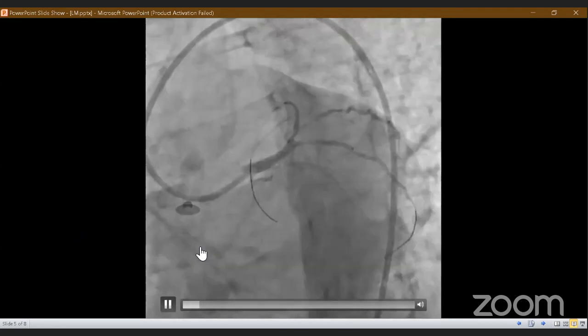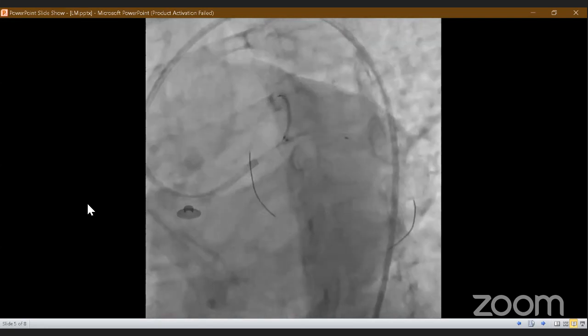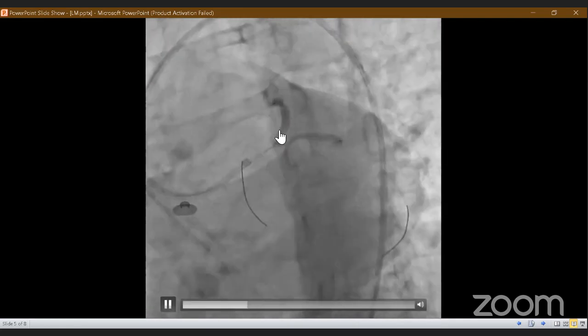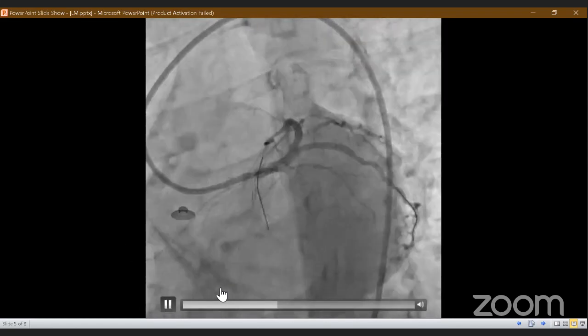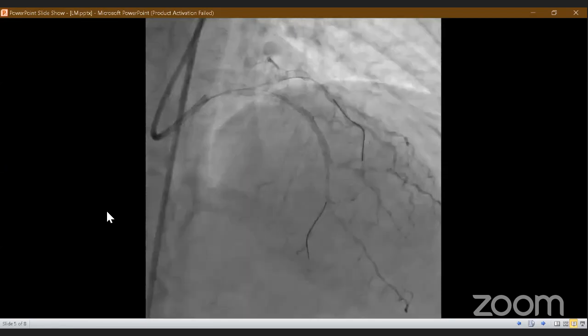So our decision was to go for a V stenting. We inserted the 7 French guiding catheter and of course wired both vessels, and simultaneously we put the 2 stents at the same time for the LAD and the LCX, and we did simultaneous inflation with the dots just inside the left main, so both stents are just kissing each other at the ostium. And that was the result after deployment.